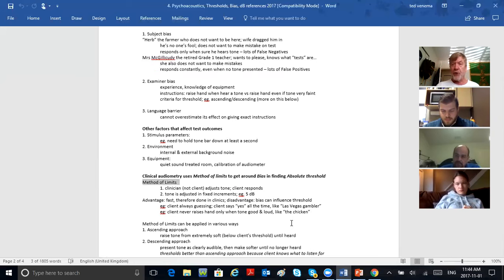We don't test at 43 dB. We test at 40 or 45 or 50 or 55. We test in increments of 5. We said you can use the method of limits in a descending way. In other words, starting with a tone that's clearly audible and then going down, down, down until the guy doesn't hear it anymore and calling that threshold.